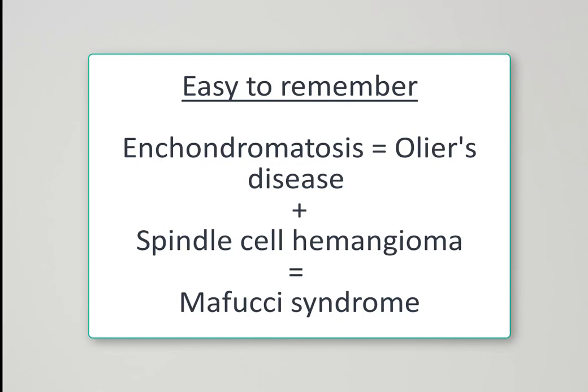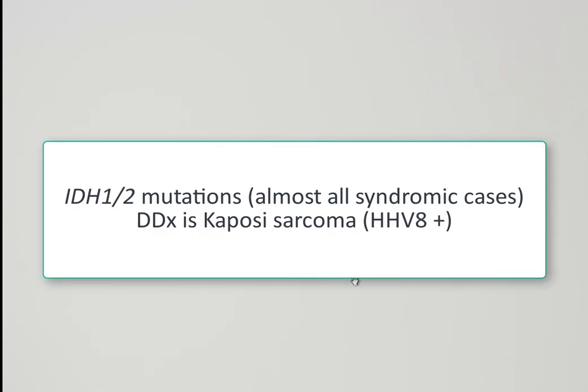Of course, these tumors are negative for HHV8, but the morphology is enough to call this spindle cell hemangioma.